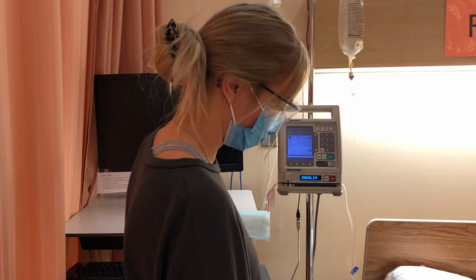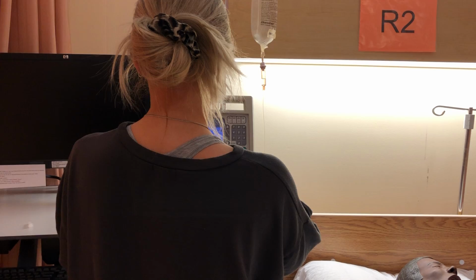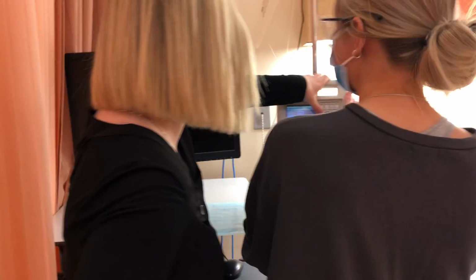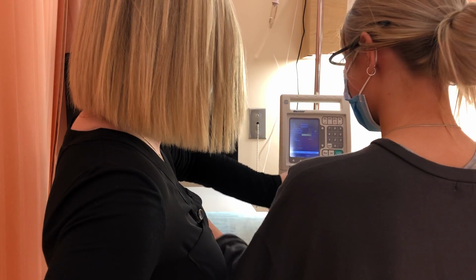Started, okay. This demo, and then I got my mini bag, and because they're used in demo, I just have to flip it upside down here. Spike my medication back here.